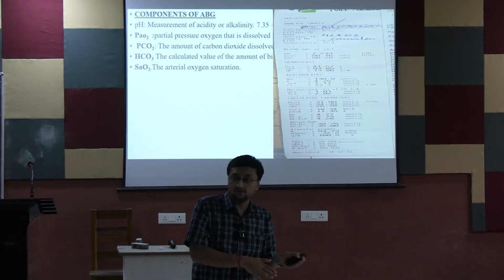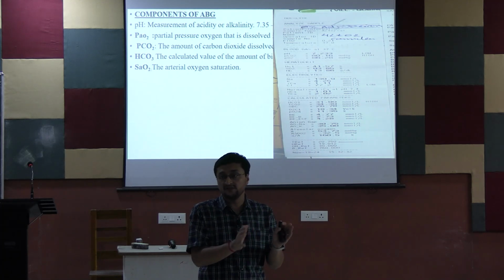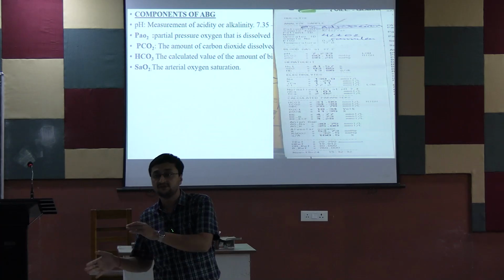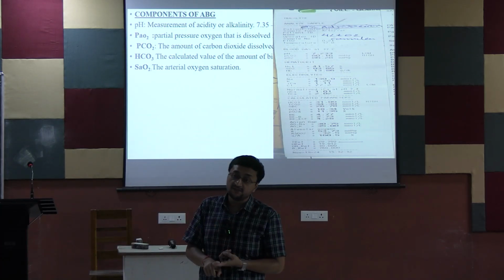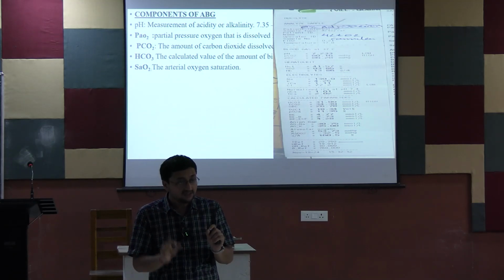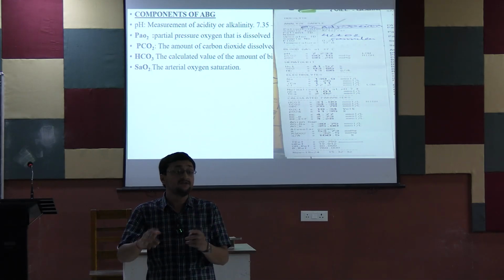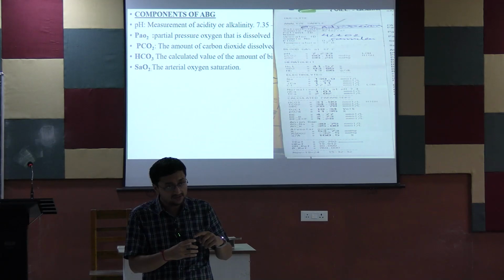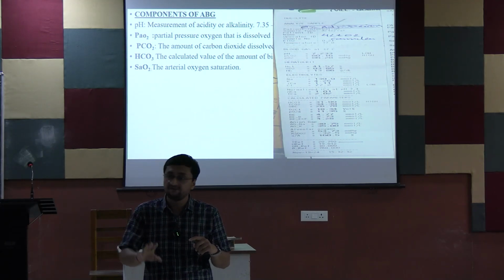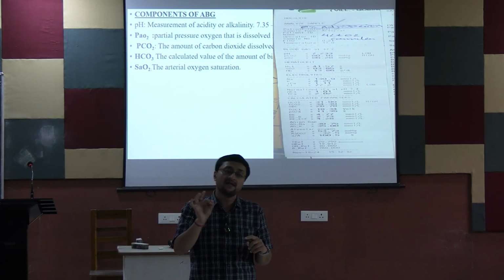Okay, so this is why this is important, because if you have wrongly drawn the VBG, venous blood, then কি করে বুঝবি যে whether this is a correct ABG or a VBG? So by estimating the SaO2, if this is arterial blood, then the SaO2 will be quite similar to your SpO2 that is seen in the pulse oximeter. Patient এর pulse oximeter লাগানো আছে, সেখানে suppose the saturation is 95%, okay, and suppose your SaO2 in the ABG is showing a saturation of 92.